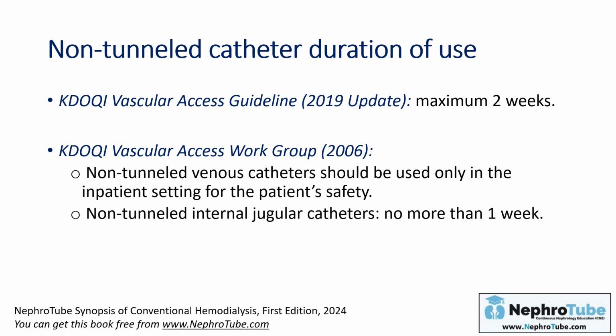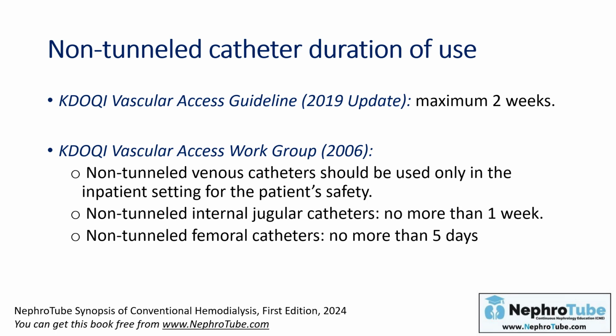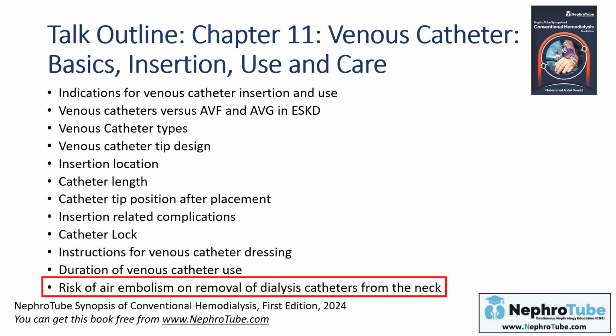The non-tunneled internal jugular shouldn't be used for more than 1 week, and the non-tunneled femoral catheter no more than 5 days, and the patient should be bed-bound with good exit site care. I think this is safer than making it a maximum of 2 weeks for all types of catheters.